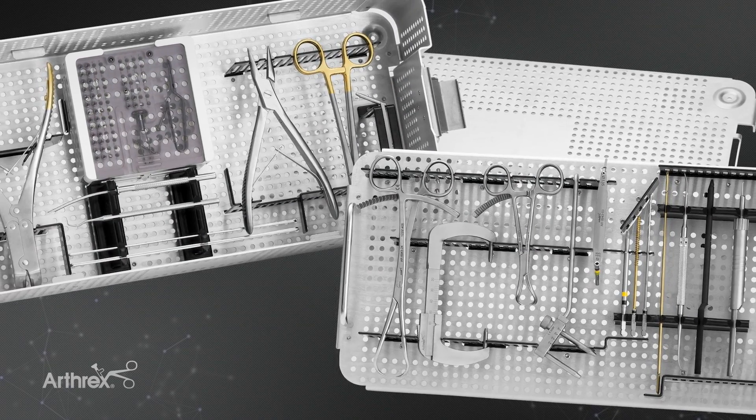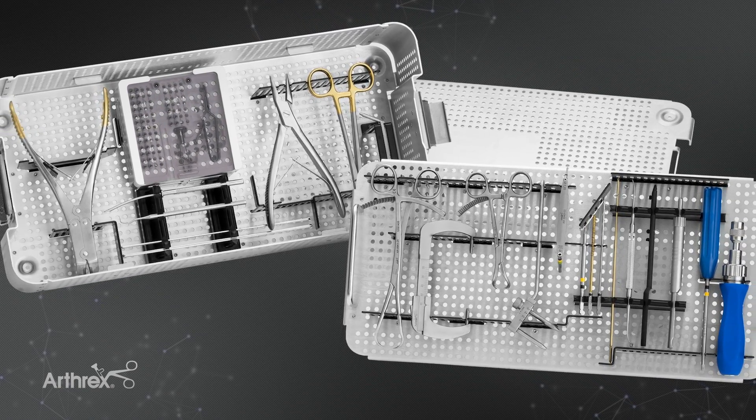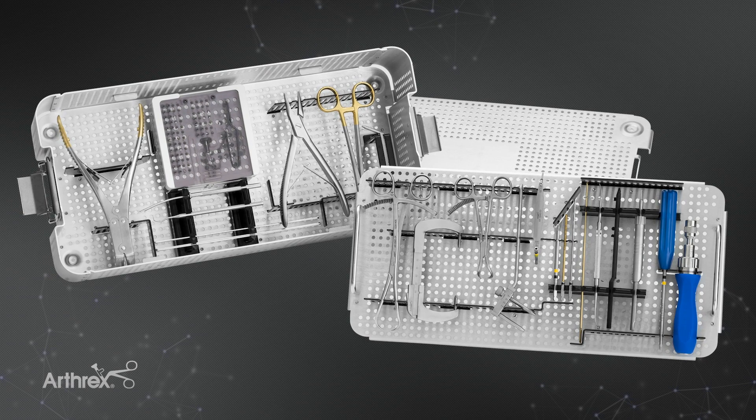The set itself is complete with a series of needle drivers, pliers, and wire cutters — typically everything the surgeon needs in one set to fix the majority of patella fractures.